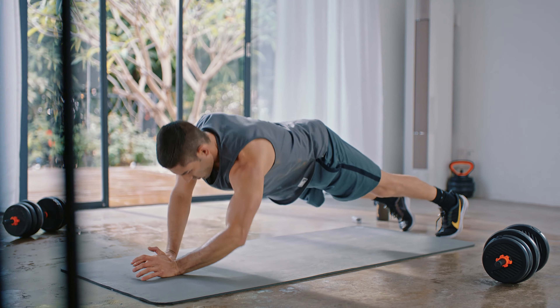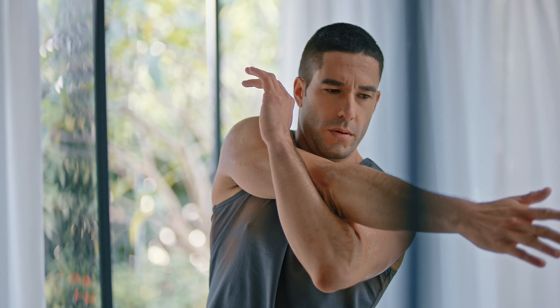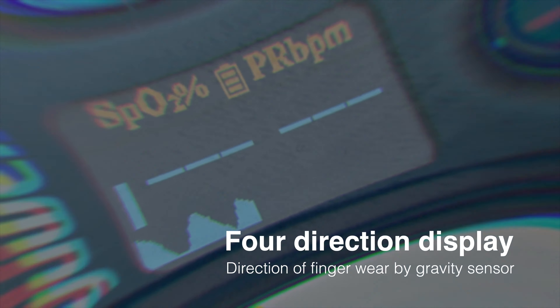Nothing is as important as your health. One button control. Automatic detection of finger direction. The U-Well Oximeter provides an accurate way to check your pulse rates and blood oxygen saturation levels hassle-free.